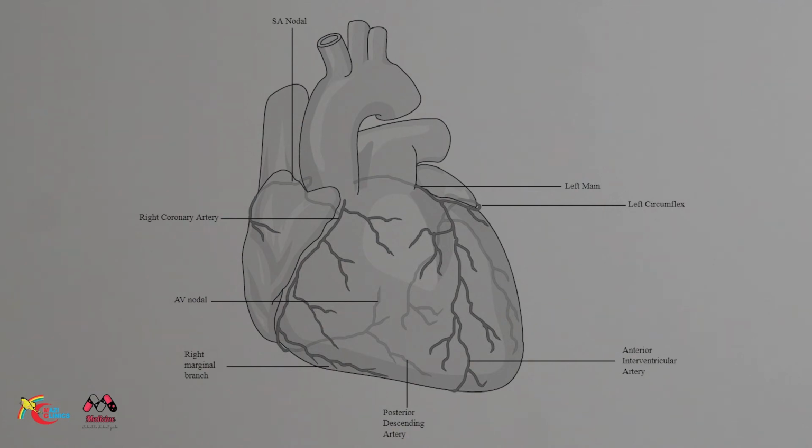From the type of myocardial infarction, we can also suspect the artery responsible for the infarction. If it is an anteroseptal myocardial infarction, we can suspect the left anterior descending artery. If it is a myocardial infarction in the lateral leads, then we can suspect the left circumflex artery or the diagonal branch of the left anterior descending artery. If it is a myocardial infarction of the inferior aspect of the heart, then we can either suspect the right coronary artery or the left circumflex artery.